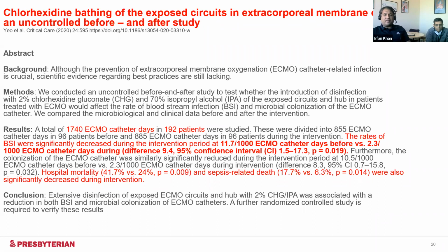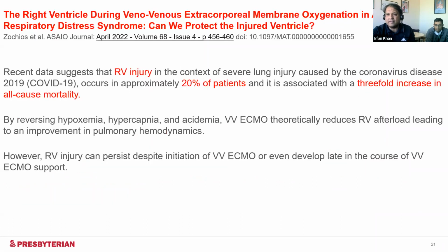So again, this is something that we have implemented at our center, and we've had huge success with it. Basically, we didn't have a CLABSI on ECMO for almost 5 months. Going from almost every patient getting CLABSI to none for 5 months is a huge success. Now let's talk a little bit about the right ventricle.